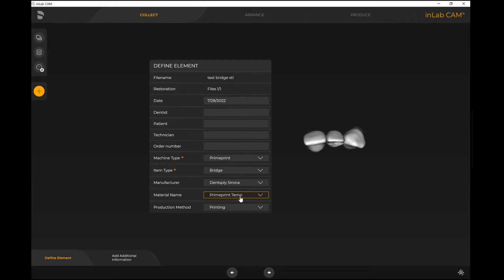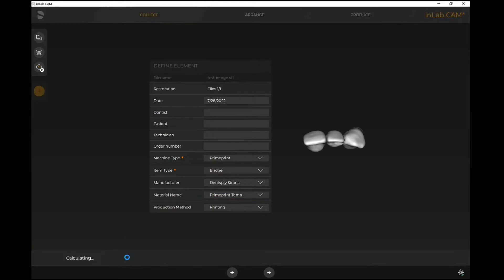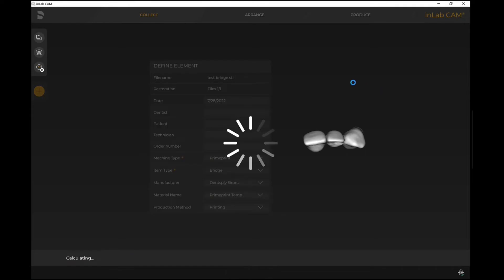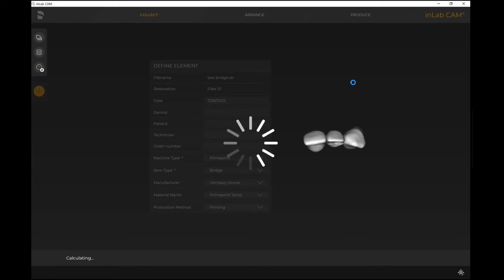The next step is for me to add additional information. I can either get to it with the arrow here or just by selecting Additional Information in this next step. For items like restorations, bridges, crowns, whatever it might be, it's important that the system is able to identify where the margin is, just so it knows where the key elements are on this restoration.